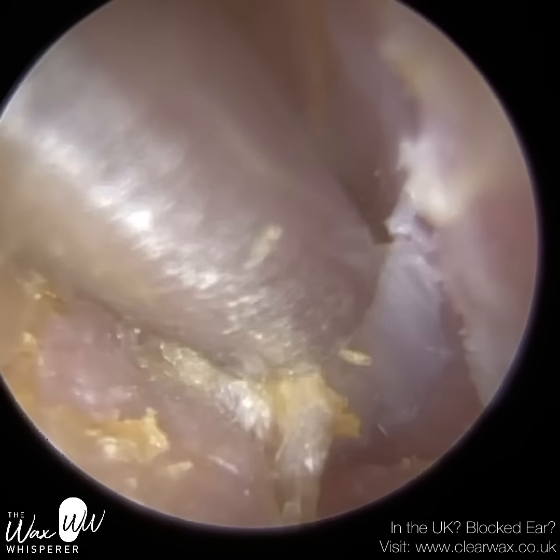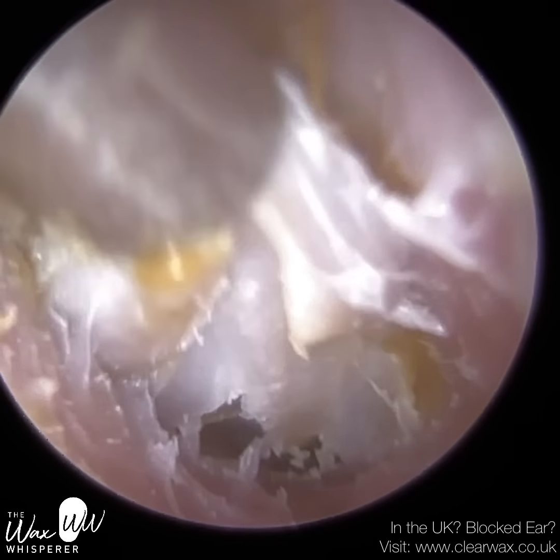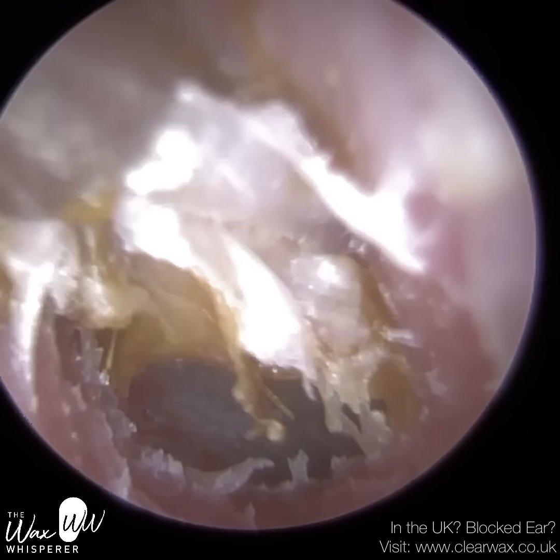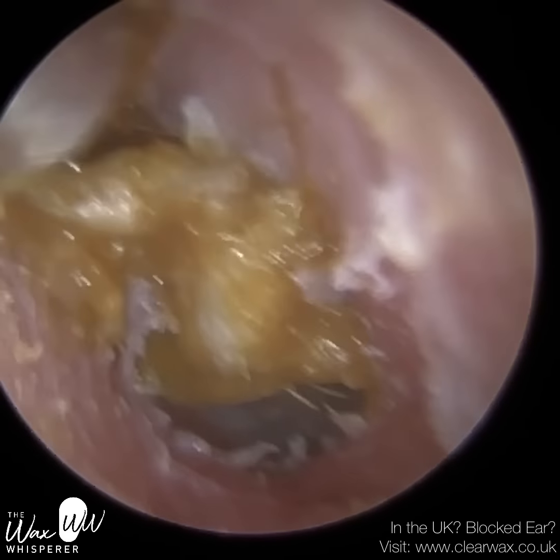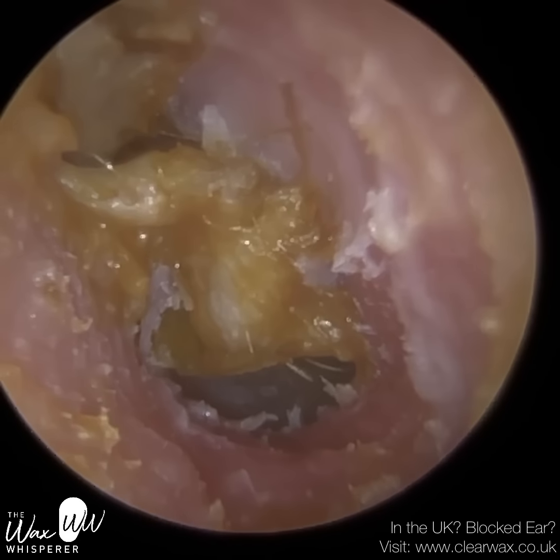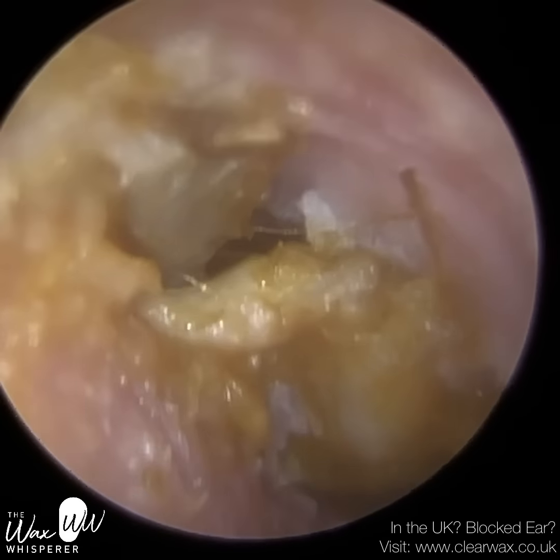On the left side, we really had little option with the final bit on the eardrum. And again, I didn't overuse the drops. I just put enough to soften and settle on the eardrum. That's because when you've got an infection, you want to keep the ear as dry as possible. You don't want any moisture in there. But so far, we're fine with this ear.